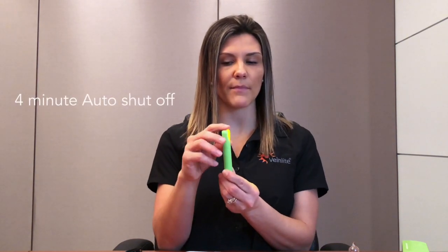To turn off the Veinlight Neo, cycle through all three colors until it turns off. Or, press and hold the top button and it will turn off.